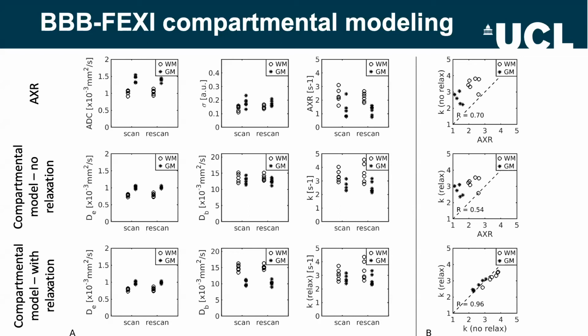Well, from a mass balance perspective, we expect them to be equal. The same overall number of water molecules should exchange in both directions, at least at a coarse estimate. There is water exchange in other parts of the central nervous system, for example with the CSF, and potentially into the perivascular spaces as well. But to first approximation, you would expect the exchange in both directions to be the same in terms of the total quantity of water.